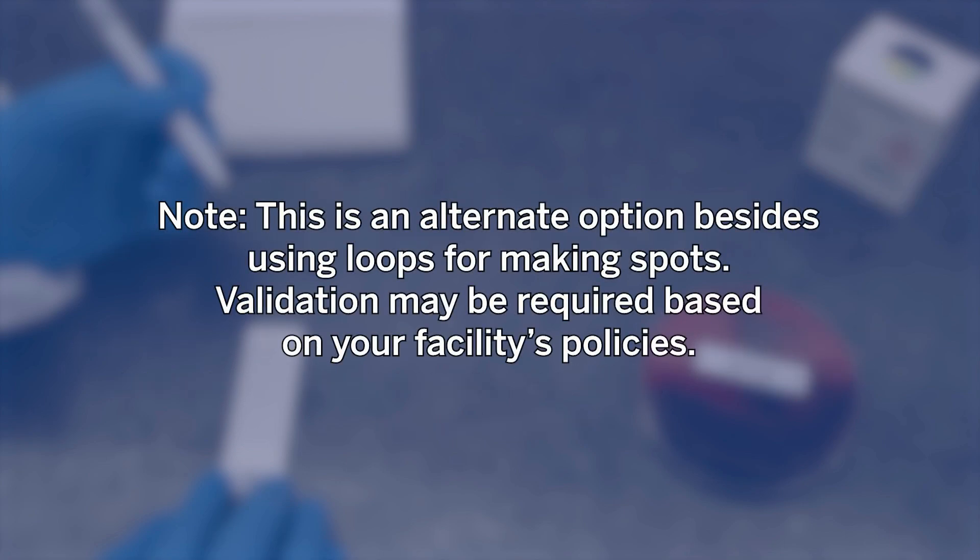This is an alternate option besides using loops for making spots. Validation may be required based on your facility's policies.